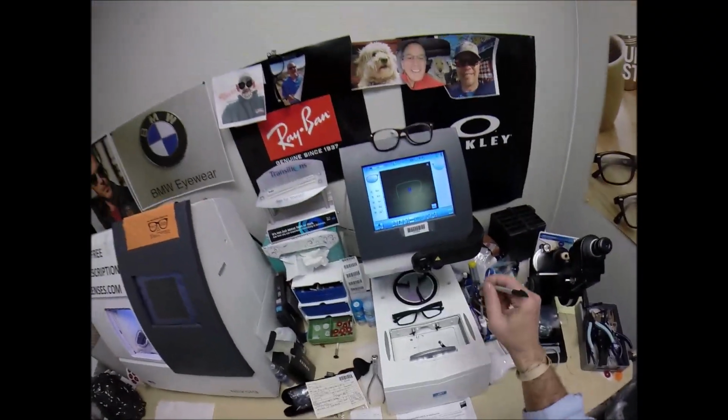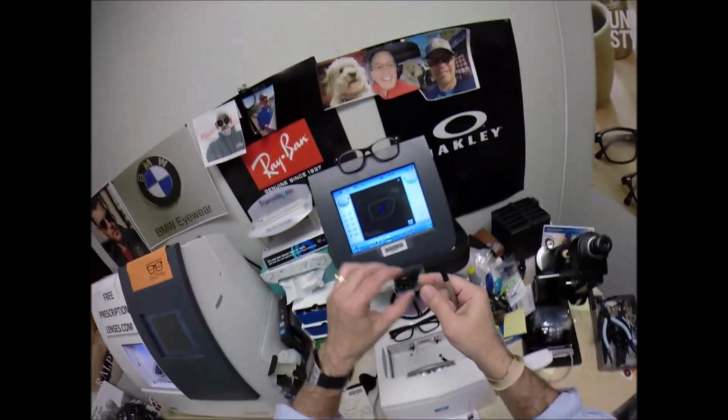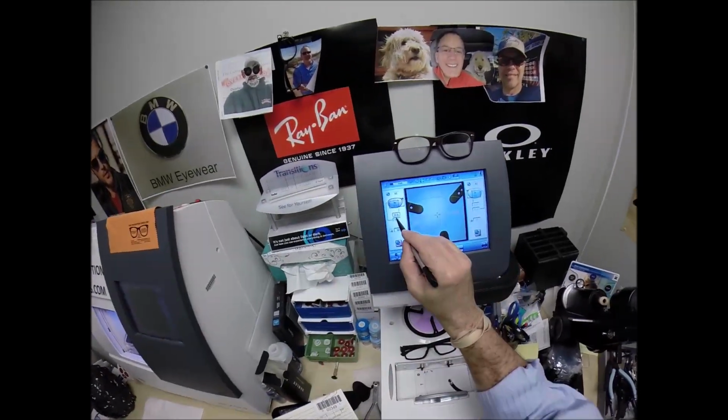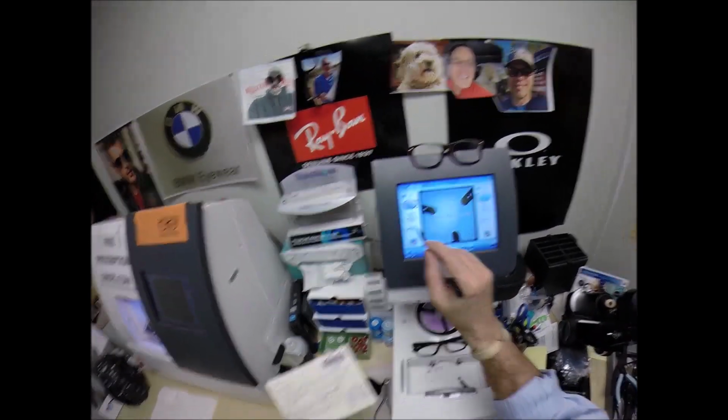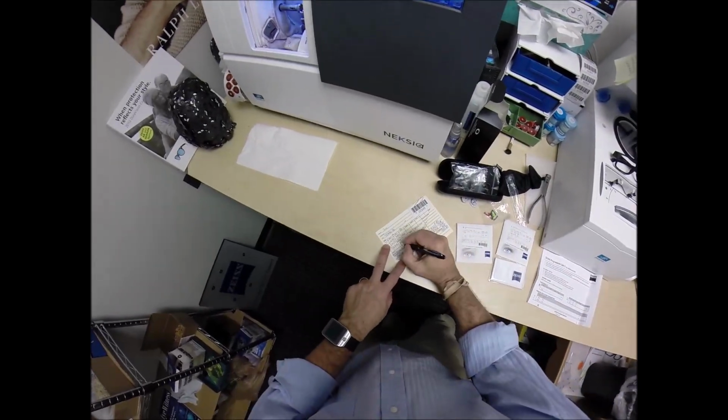So that is the shape that I'll be cutting. That is the shape of this lens. And let's move on to the next screen. Enter your pupillary distance, 32.5 for the right. I don't have to do anything, the computer starts there. I do want to raise the optical center up to 19. I forgot to write that down there. I had measured that earlier.